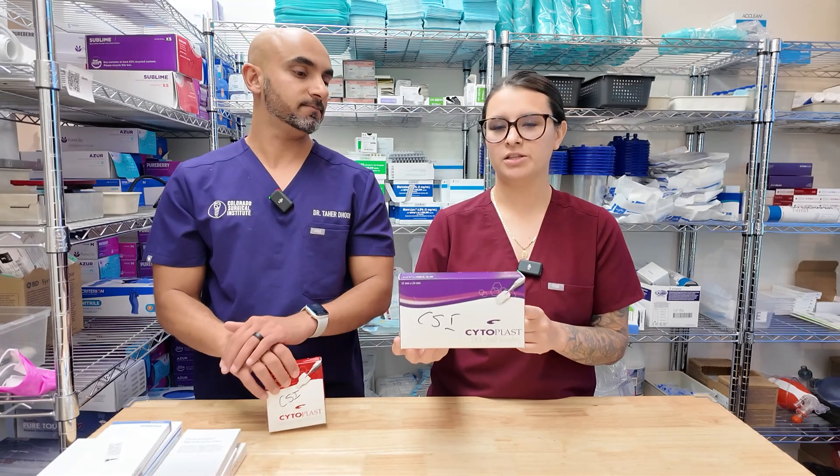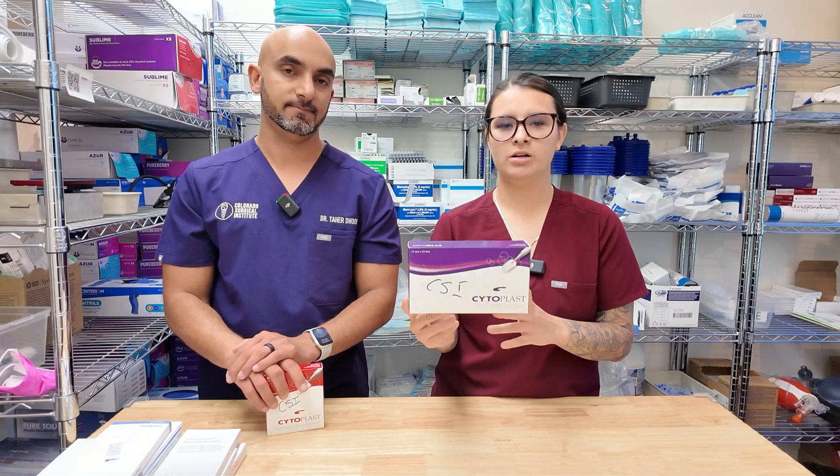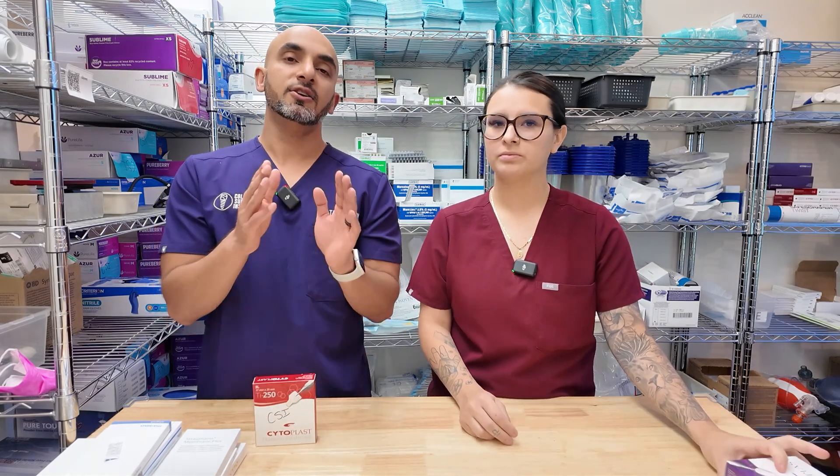They also have different sizes, so depending on how big or little you want the Cytoplast membrane, they have different sizes to pick from. You don't want the Cytoplast membrane touching the adjacent teeth — you need to trim it so that papillas can form, and you don't want it to be too big in terms of where it's approximating. Approximation and trimming it to size is really important. If you have a missing buccal plate, you can actually extend your Cytoplast membrane all the way down and cover all of that dehiscence and graft inside of it, and it's going to preserve that wall really nicely.